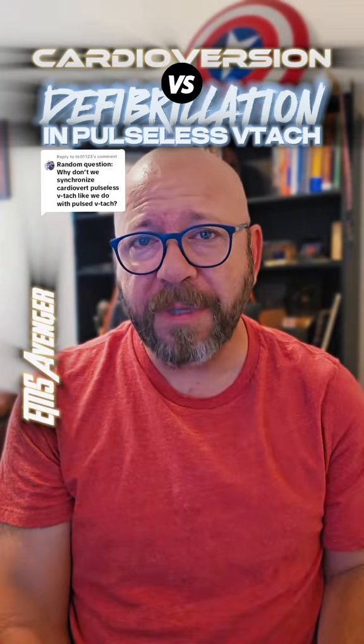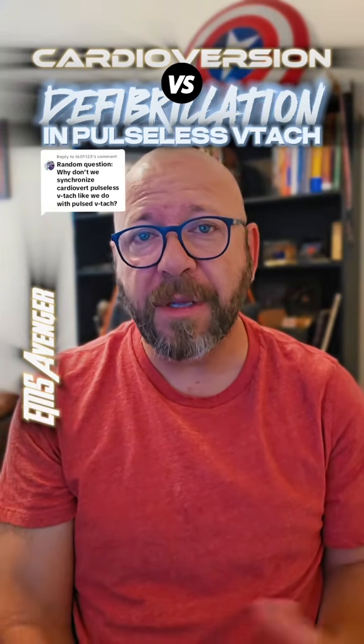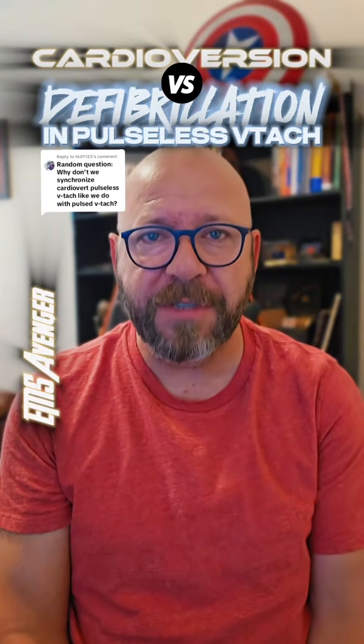Now, there are some people that think that we still should be performing a synchronized cardioversion in pulseless ventricular tachycardia, and some services and some providers do that. However, expert opinion is still to simply defibrillate pulseless ventricular tachycardia.